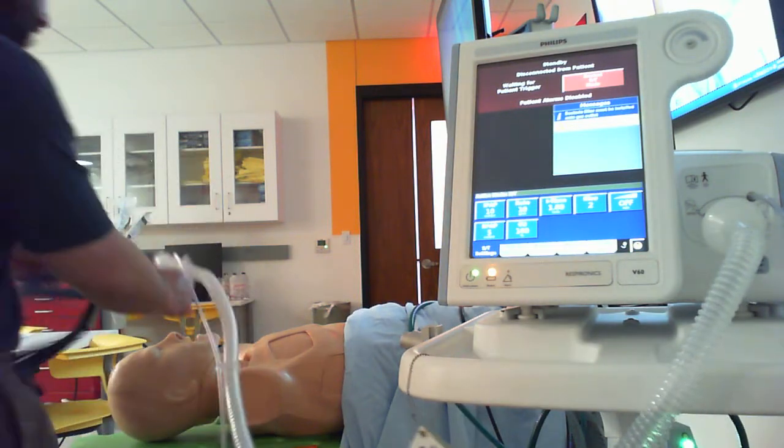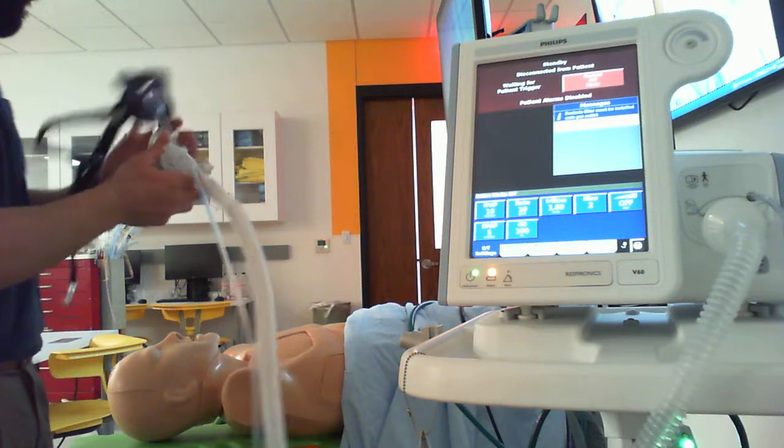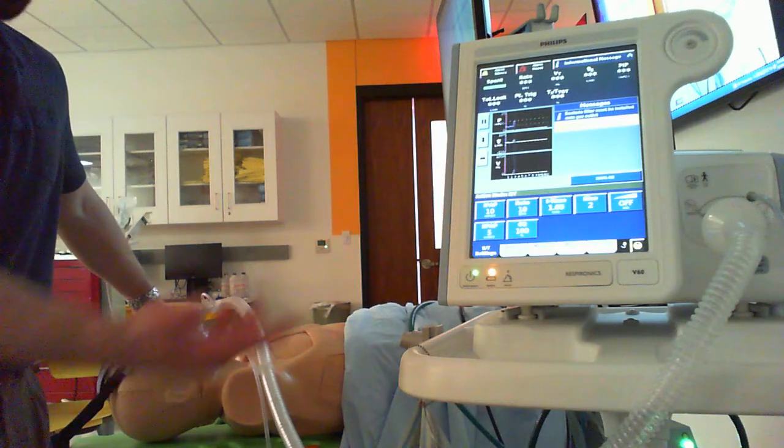So once again, I'm going to go ahead and apply this to their face. What we're trying to do is make a good seal. The triangle part should seat up on the top bridge of the nose. And I'm going to kind of seat this. If you don't have a good seal, it's not going to start up.